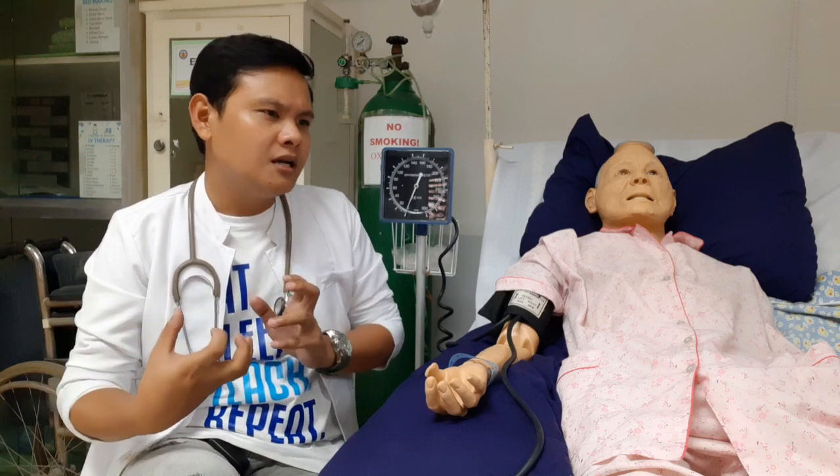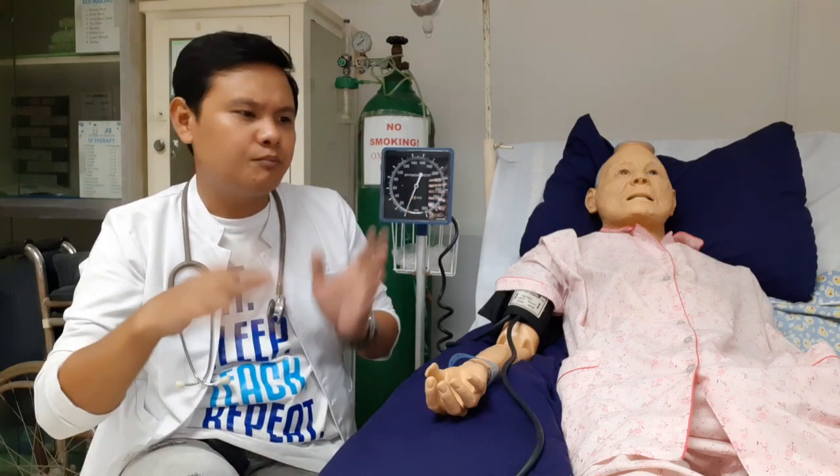Pero since ang BP taking is kasunod na to ng ibang vital signs such as temperature, pulse, respiration, isang hugas na lang, maghugas ka before temperature and then perform all the procedure. Pero kung gagawin mo lang naman is you're just going to take the BP, definitely you have to wash your hands. Okay? Next, provide for client privacy. So nasabi ko na rin sa inyo, if the patient has privacy curtain, then use it. Okay, kung wala, we can use also the portable one.